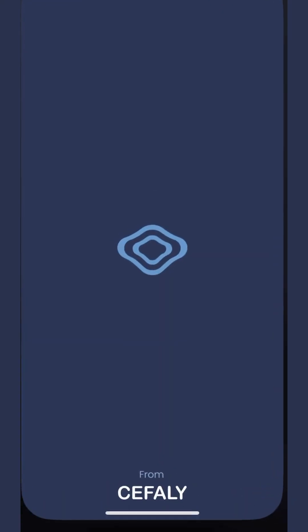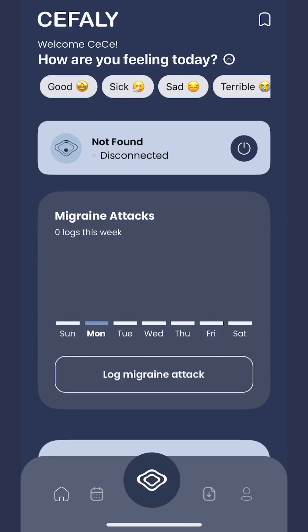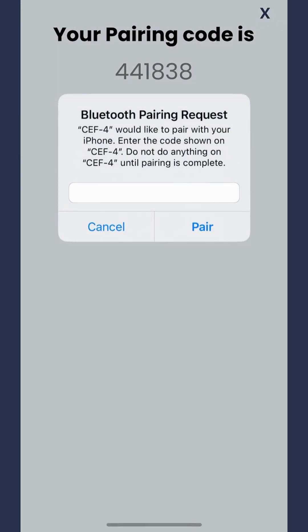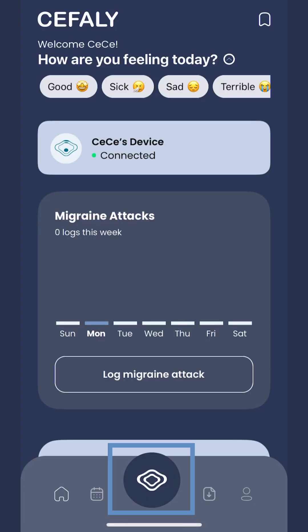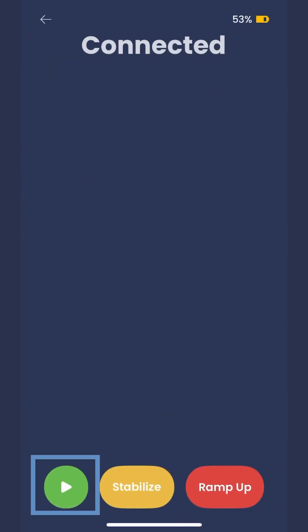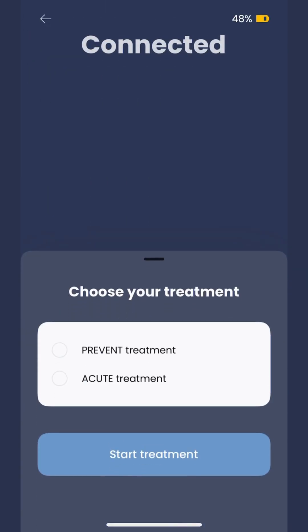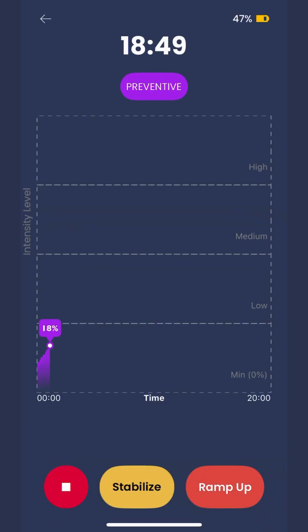To start a prevent treatment using the CC app, connect your Cephali device to the app and attach Cephali to the electrode. Tap the blue Cephali logo button, then the green play button. Choose prevent treatment and tap start treatment.